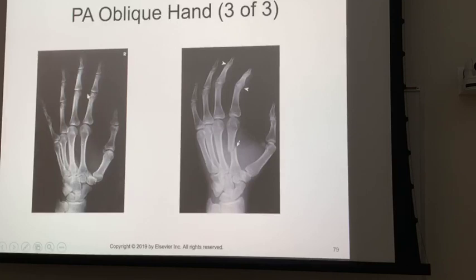It might be under rotated, but you can see the joint space is open here as opposed to over here. You see the way you don't see the joint spaces. They use the fingers as props over here. And over here they use the fingers extended. But it didn't really matter so much over here. What they were looking for is that fracture right there.